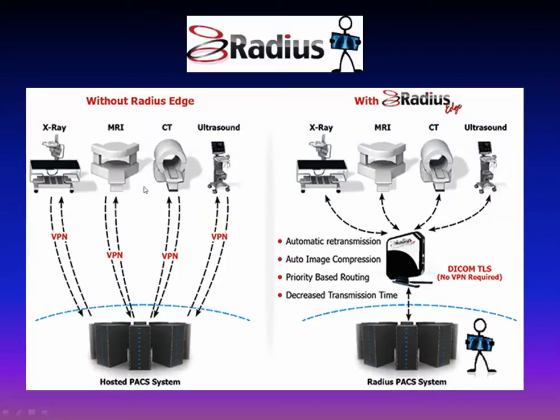Now, that case I just showed you previously, the PACS is located basically at the same location as the hospital or imaging center, whichever you're working with. However, you have to deal with things a little bit differently when the PACS is actually hosted off-site, which is the case with us. So we use a company called Radius. They're based out of Tennessee, and they do all of our IT storage and PACS and RIS for us.